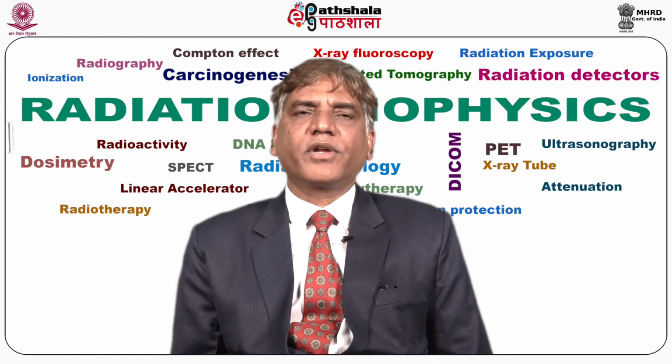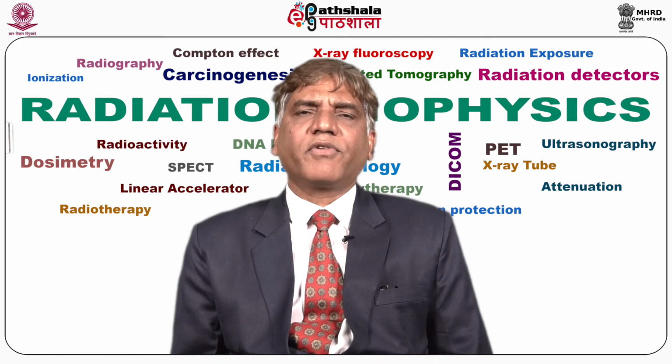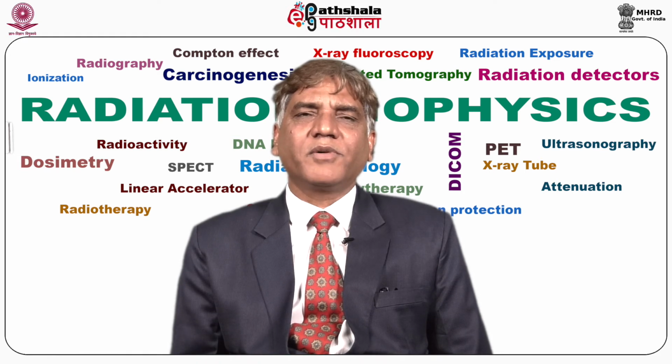The basic idea of Fourier analysis is that any function of time or space can be represented by a sum of various frequencies and amplitudes of sine and cosine values. This Fourier transformation is very popular in MR imaging.